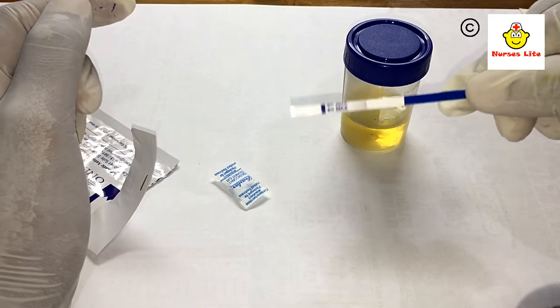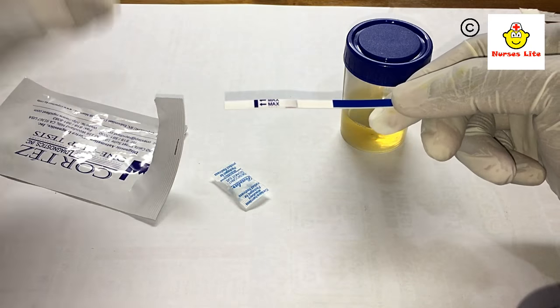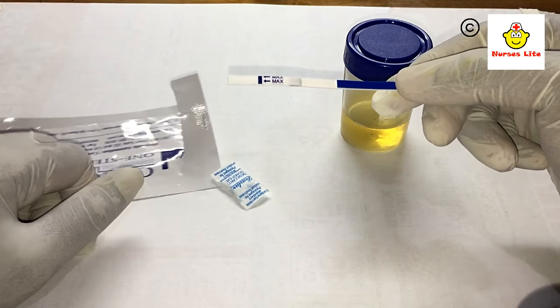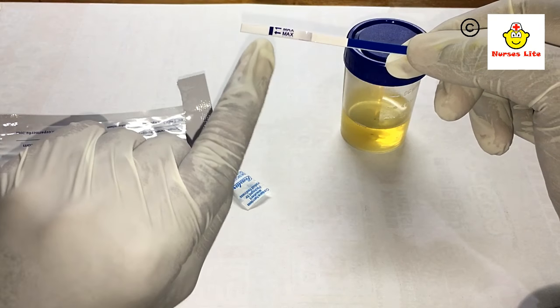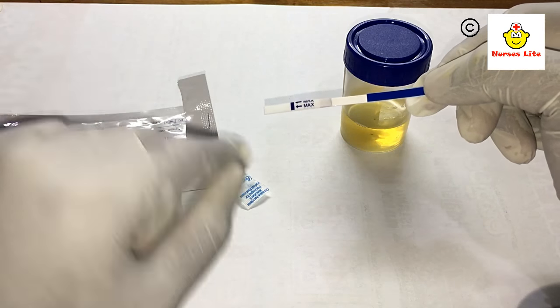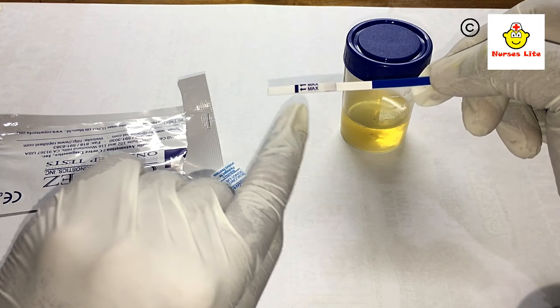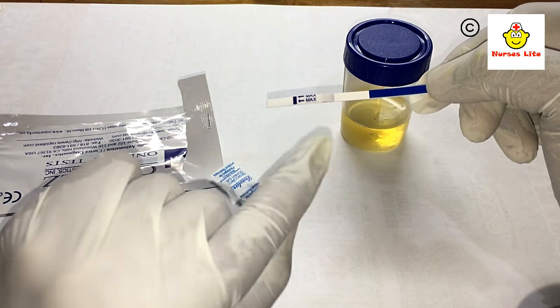Before doing this test, you should bring the strip to room temperature by keeping the package out for five minutes — it's very easy. You can see the marked max limit on the strip. Max limit means you should dip the tip only up to this limit. If you dip above this limit, it will give a false result.